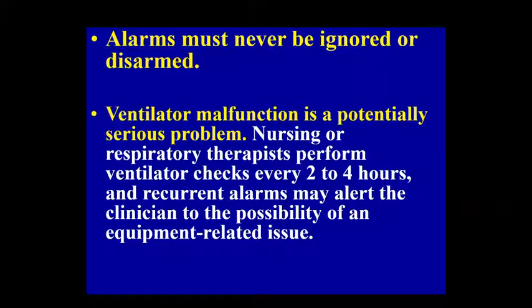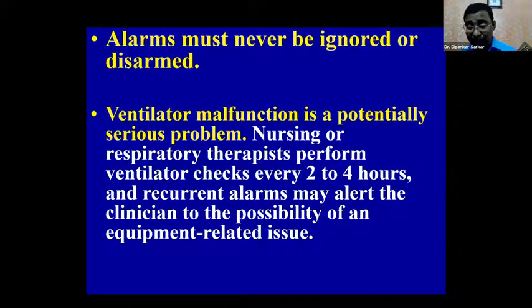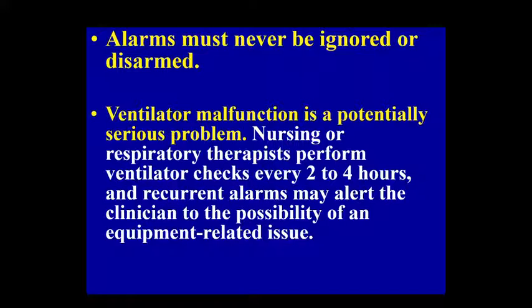So you have to identify that the machine is malfunctioning or may malfunction with certain tidbits, like it's beeping, the electric circuit is going up and down, connection, disconnection, connection, disconnection. That means that there is some problem. You alert your facility team and the team who are responsible for taking care of the machines.